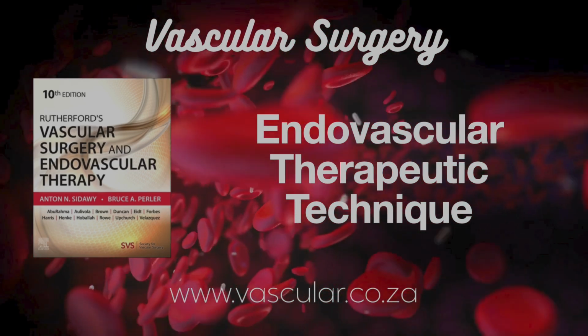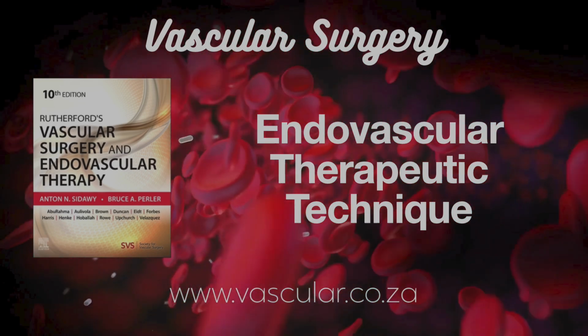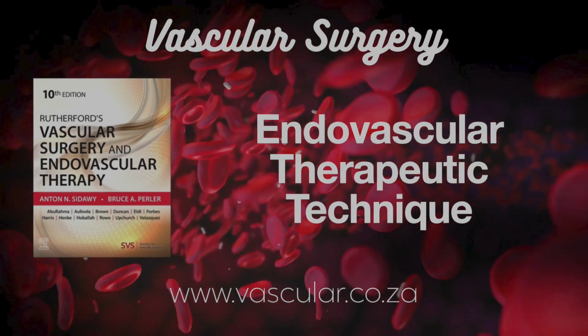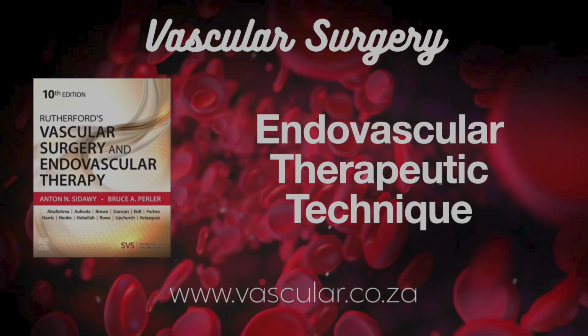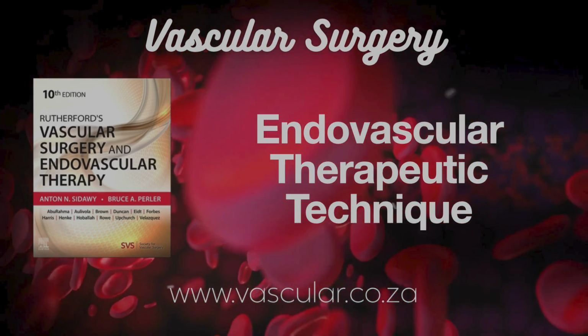Okay, that covers PTA technique thoroughly. Let's talk stenting technique. When is stenting indicated? Indications vary. Iliac lesions, especially complex TASC C and D, primary stenting often yields better long-term results than just ballooning with selective stenting. Elsewhere, selective provisional stenting is common, used as a bailout for PTA problems.